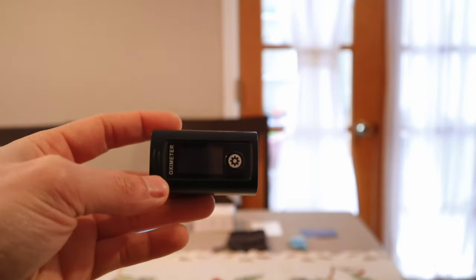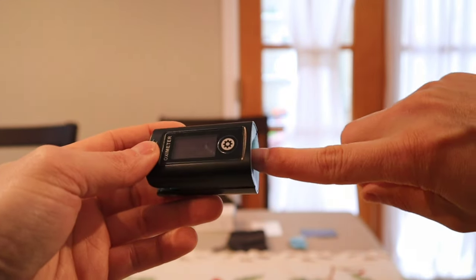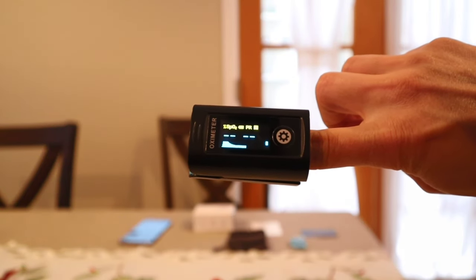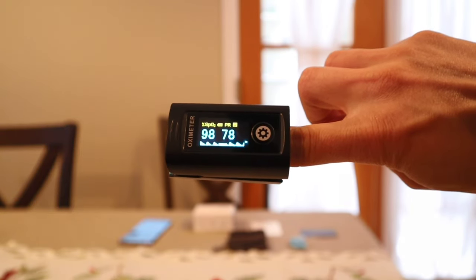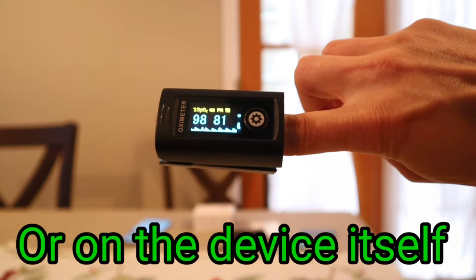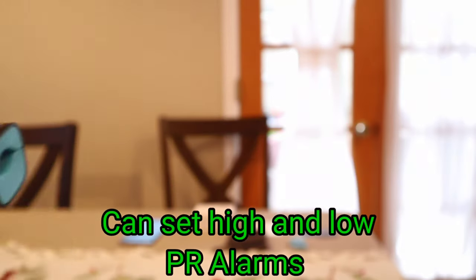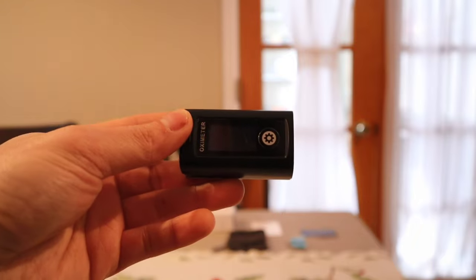So this device itself is real simple. There's actually no power switch — there's a button right here, but you don't have to worry about the button. Just place your finger on it and automatically the device will turn on, and within a few seconds it starts to measure your SPO2 levels and your heart rate. I also like the fact that it beeps at you, but you can turn that off via the app. And once you take it off your finger, the unit will automatically shut off after a few seconds.